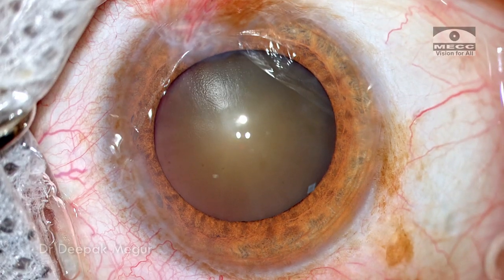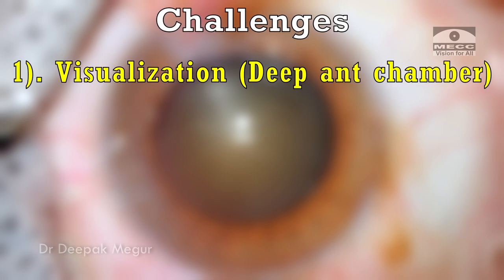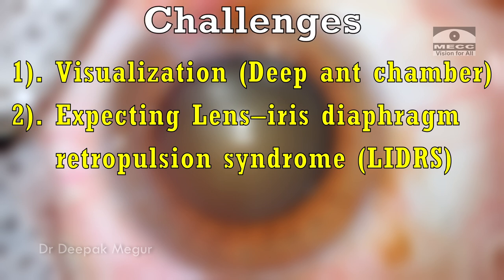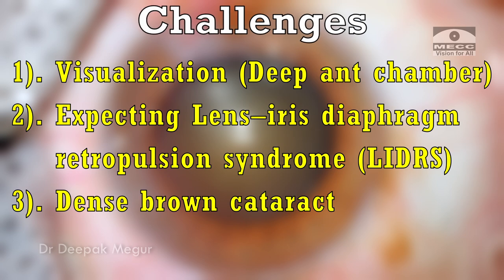We are dealing with a long eye and the challenges are: we are going to work under a very deep anterior chamber, the visualization might be a little bit of an issue, and apart from that we expect lens-iris diaphragm retropulsion syndrome. These are things very specific to myopia. This patient additionally has a slightly denser cataract — let's see how things turn out.